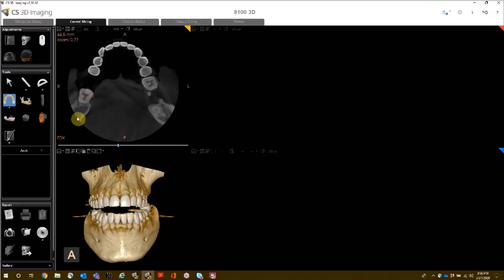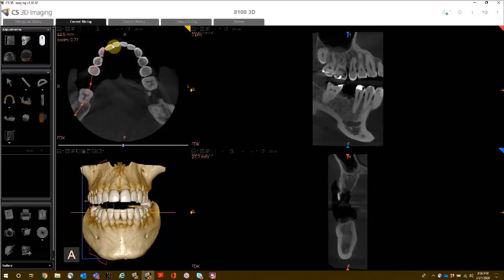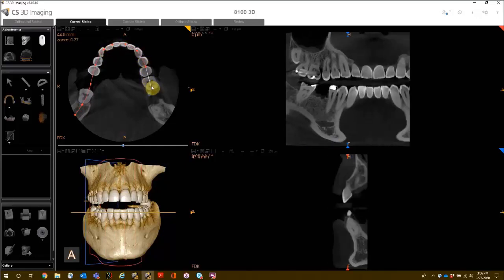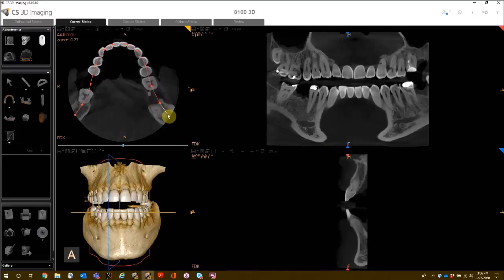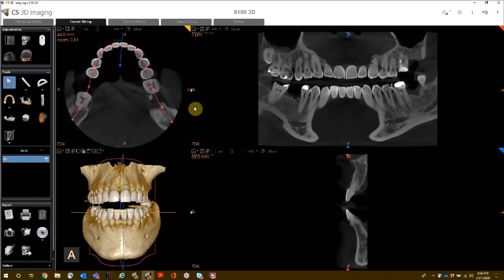Once you have selected the arch creation mode, in your axial view screen, you will start on the right side at the edge of the arch and create a series of single left-clicks. Click about every one to two teeth until you have gotten to the other side of the arch. Once you have reached the other end, double left-click to end your arch creation.